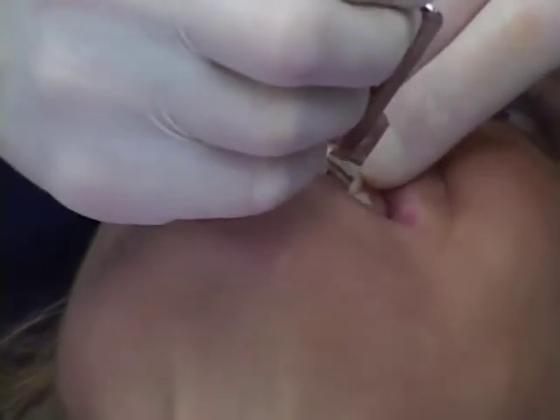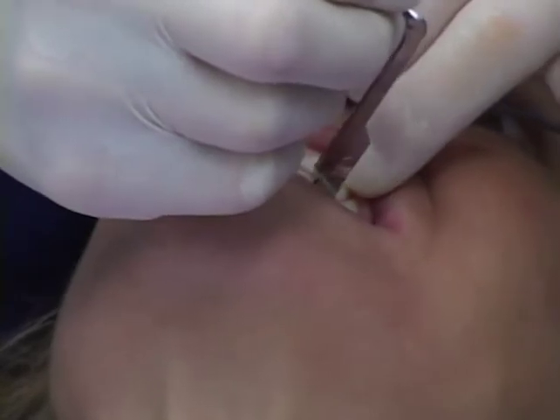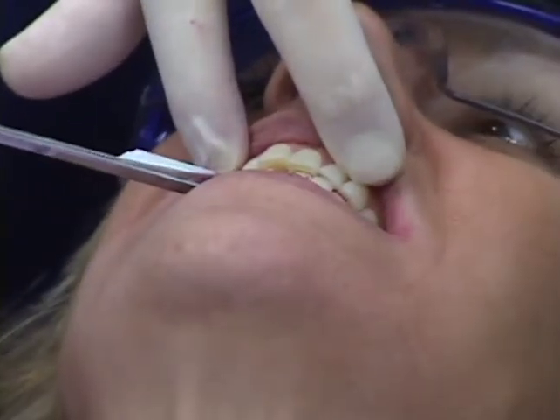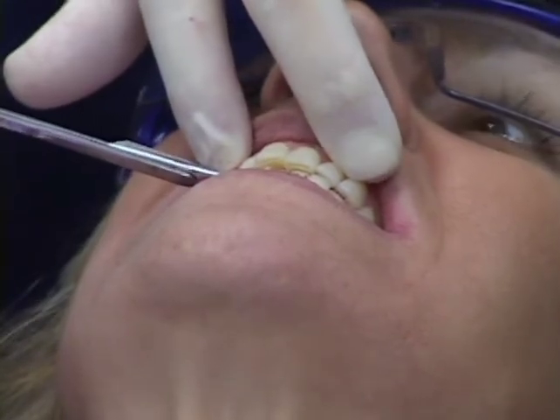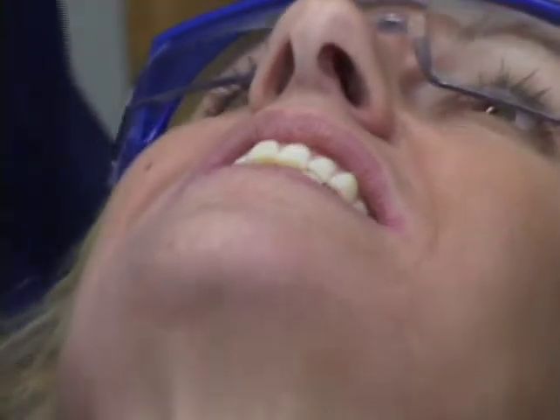Close down here. What you find is that's exactly what we have on numbers 11 and 22. And even on numbers 6 and 27 - even though it's light, we have contact there too. And that's a good point to stop. I'm very, very comfortable with that.